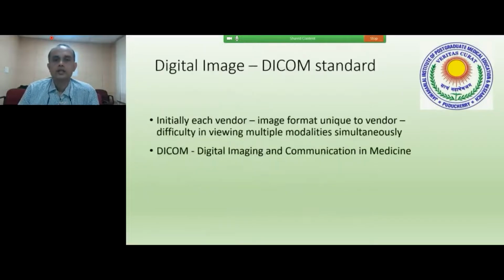Now, as I already told, the digital image is the basis of the PACS, and for that, the digital image should conform to the DICOM standard. Initially, each vendor had an image format unique to the vendor, and it was very difficult to view all these multiple modalities simultaneously in the PACS. For this reason, DICOM was introduced. This refers to digital imaging and communication in medicine. That is the expansion of DICOM.